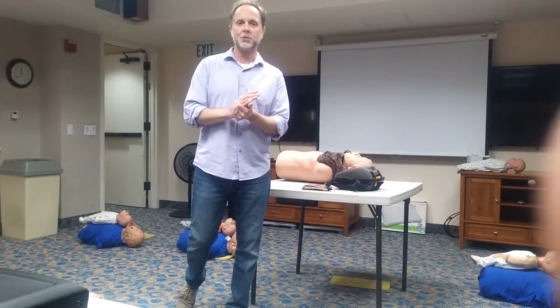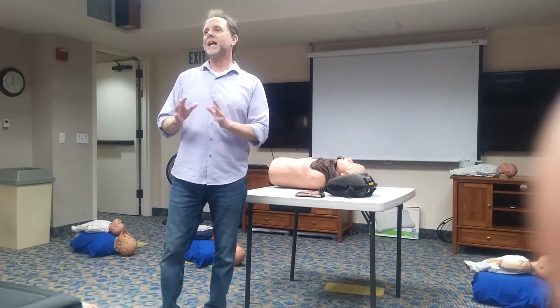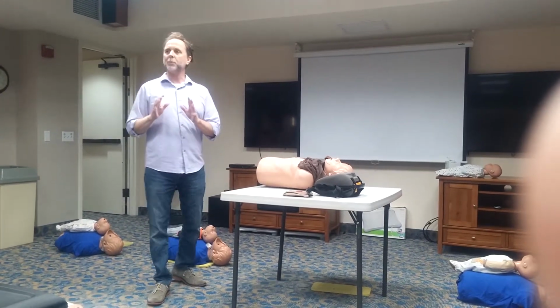I want to refresh your memory on a few skills with the AED since you just got those AEDs in your stores. A couple of quick points. The AED does not tell you whether the victim has a pulse or not. It only identifies two heart rhythms, ventricular fibrillation and ventricular tachycardia. So it does not tell you whether you have a pulse or not.